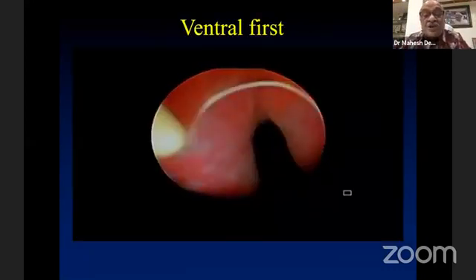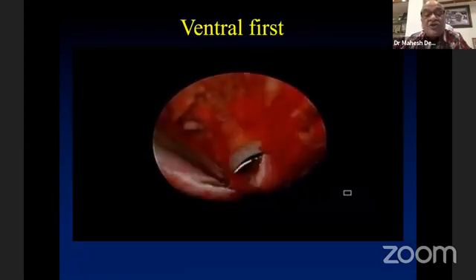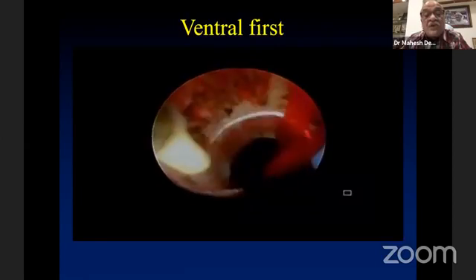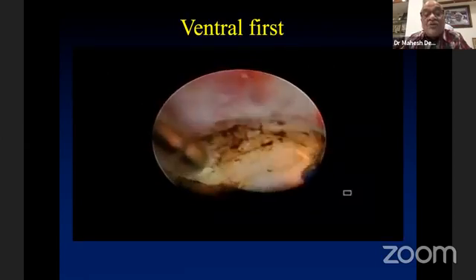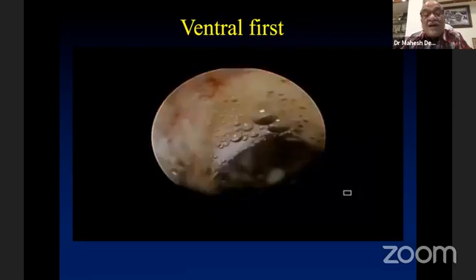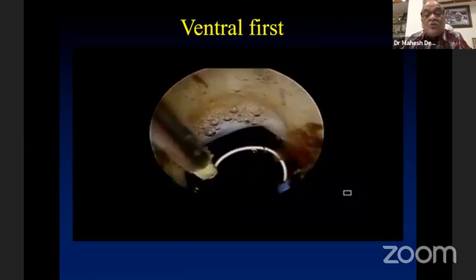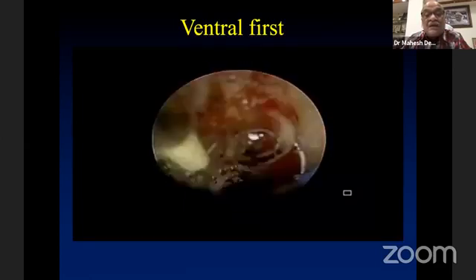So this is the prostate. This is at 12 o'clock. Now here I start because there is hardly any tissue at 12 o'clock and you would reach the capsule very quickly. Once you know the capsule, you know your plane, where you are going. And then from there, I go along, exposing the capsule up to 3 o'clock. So I will start resecting it.